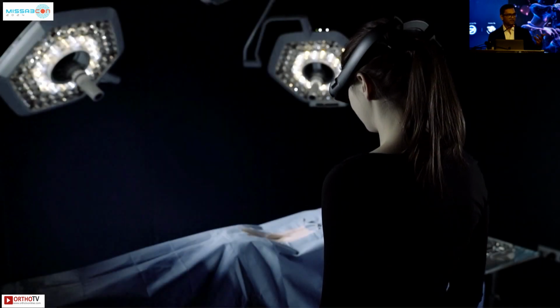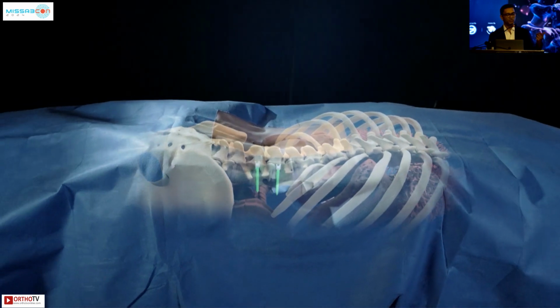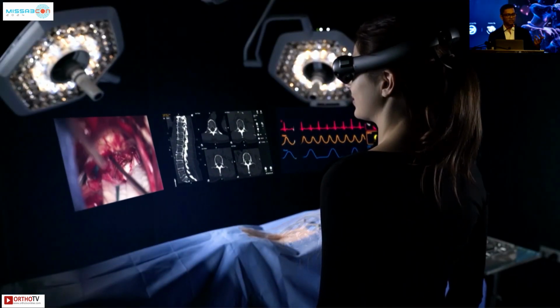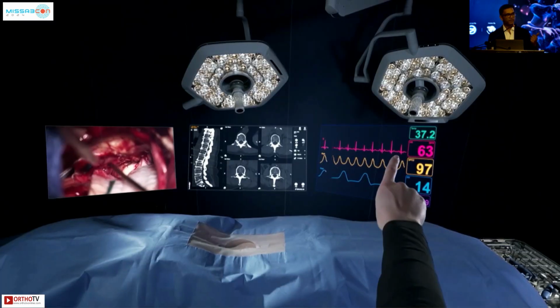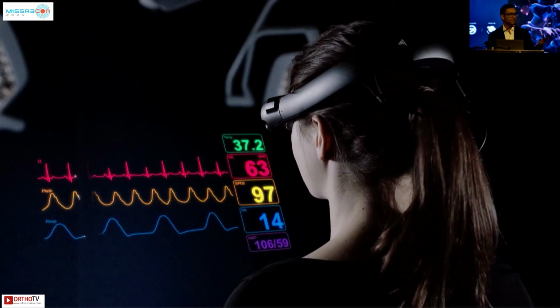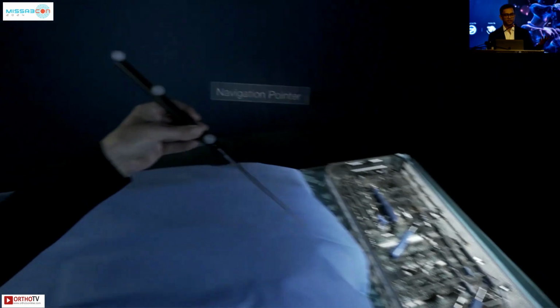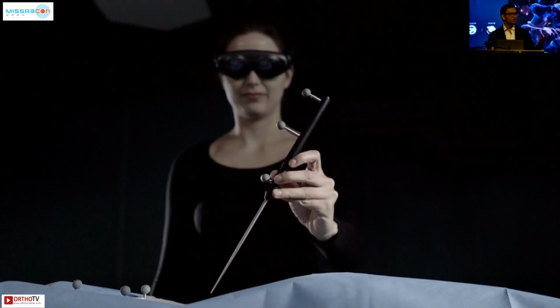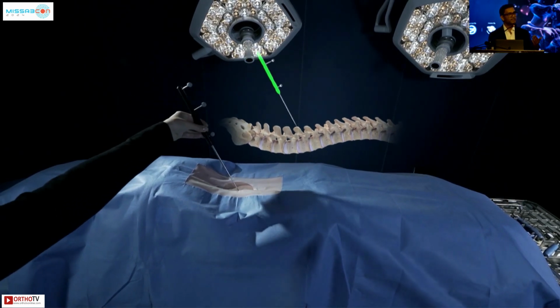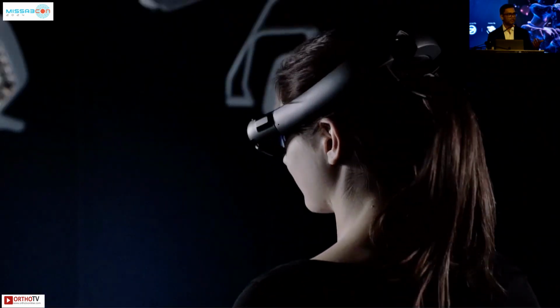And what if your future is something like this, where you can just wear a lens and you're able to see the technology right in front of you. You can see the length of your screw. Through your lens, you can have multiple monitors where you can see your operating field, your navigation, your 3D image, you can take a picture, you can communicate with all this technology. So this is not far away, this is already there. This is already coming, already in use, already in trial phases, and already being used in many parts of the world.